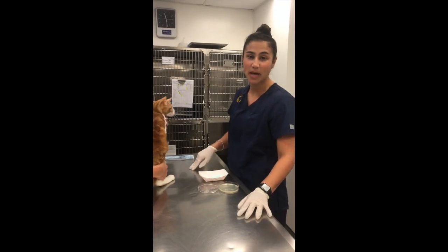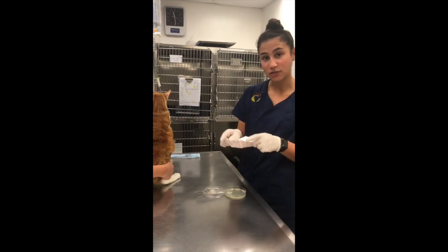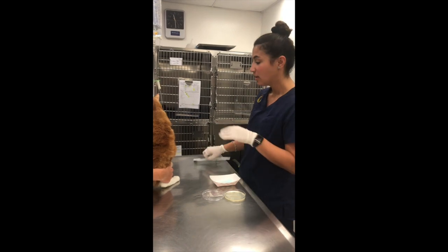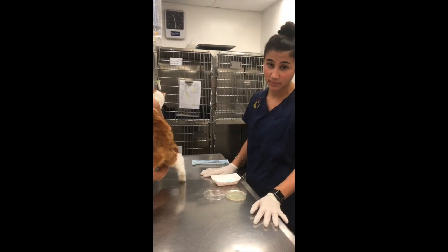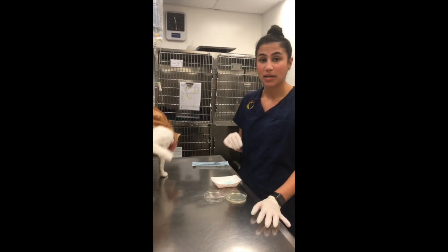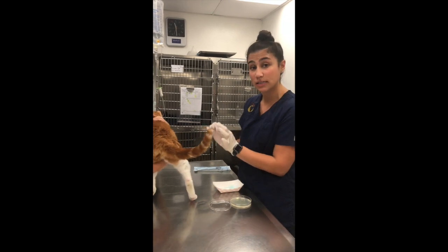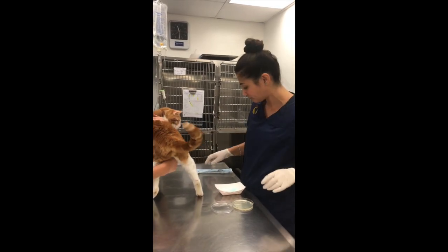Today we're going to be doing dermatophyte testing. I have my agar plate here. I have a little scrub that I'm going to do, and then I have my sterile hemostats. Today Captain came in because he had a few lesions and he's been suffering from alopecia. So I'm going to pluck 10 to 20 hairs from a specific area, mainly focusing around the lesion and around the edges, not directly on the lesion.